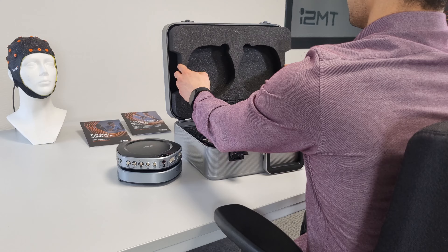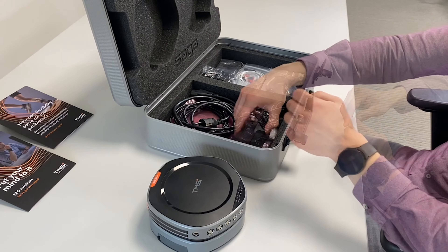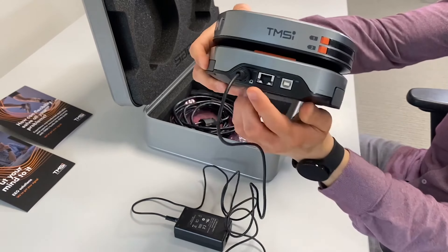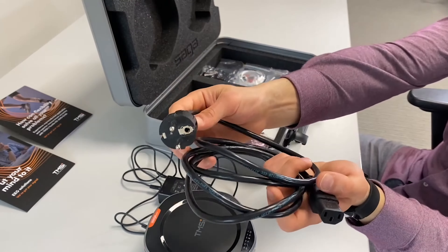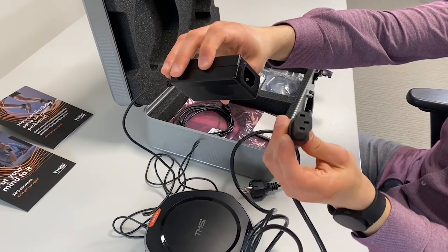In the lower compartment of the suitcase, you can find the accessory kit that is provided with Saga. The power adapter can be used to power on the device and should be plugged in at the back of the docking station. A power cable to complete the mains power adapter is provided for your specific country, and the power cable can be plugged into the power adapter.